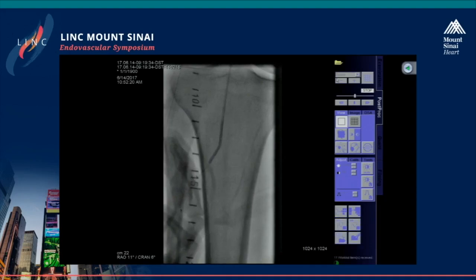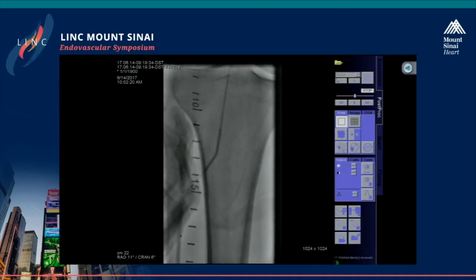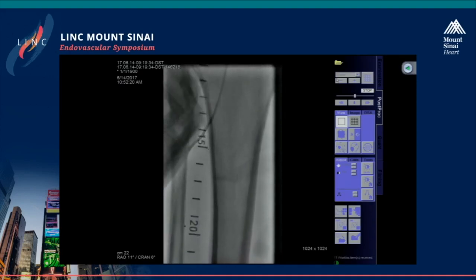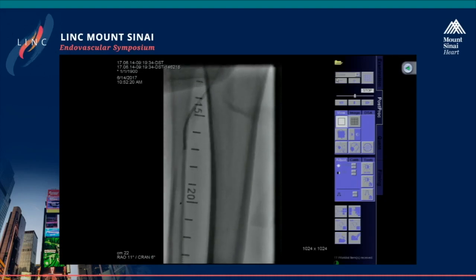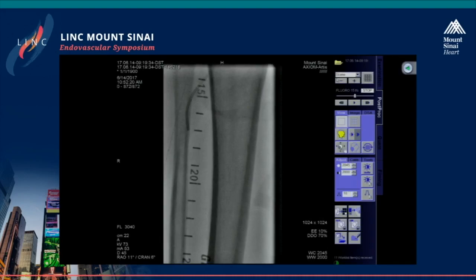Right, so as PK is working down that lesion, I'll tell you, the more we find ourselves from the get-go with difficult anatomy, lots of collaterals from the stump, or complex multi-level disease, honestly, I would just get my distal target vessel, which would be the anterior tibial potentially, and then do a retrograde access.